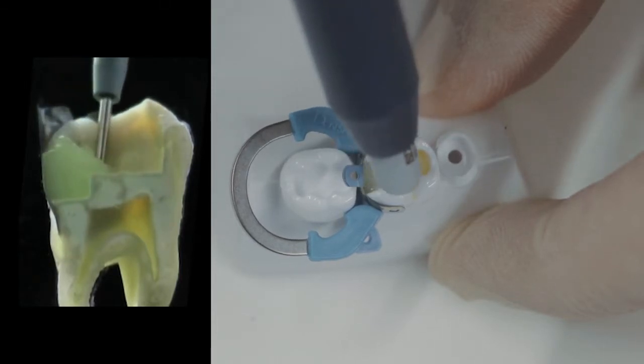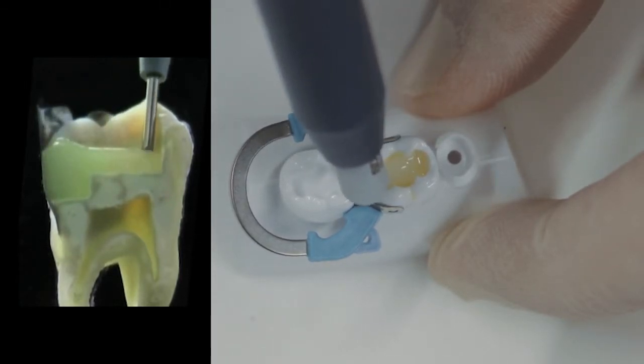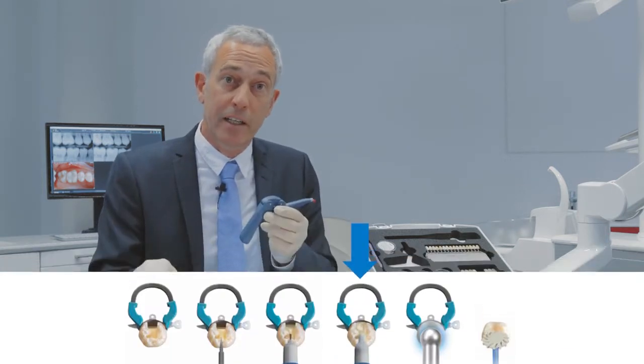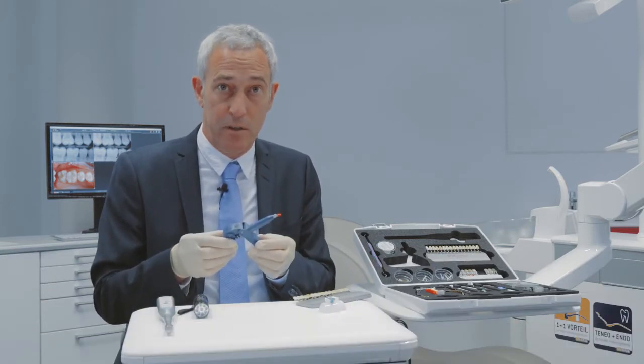It nicely adapts to all cavity surfaces. This behavior is shown in the video. Please notice also the so-called self-leveling effect that is unique for SDR. The outstanding adaptation of SDR increases the quality of the restoration, and the bulk fill procedure saves time for the dentist. After light curing of SDR, a final layer is placed with a sculptable composite in order to create the final anatomy of the tooth, the final aesthetic result, and to be more resistant to wearing down from chewing forces.